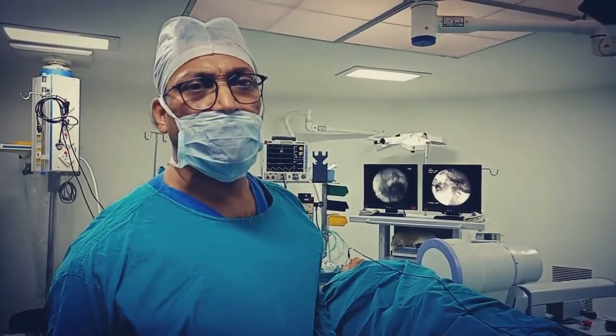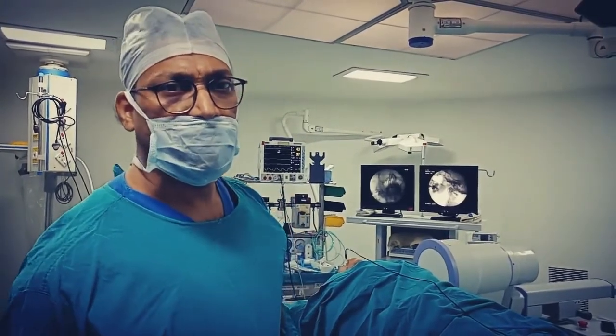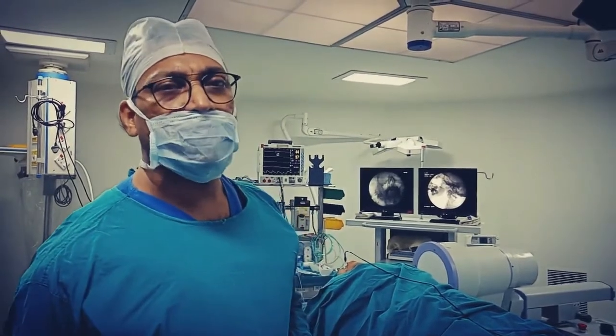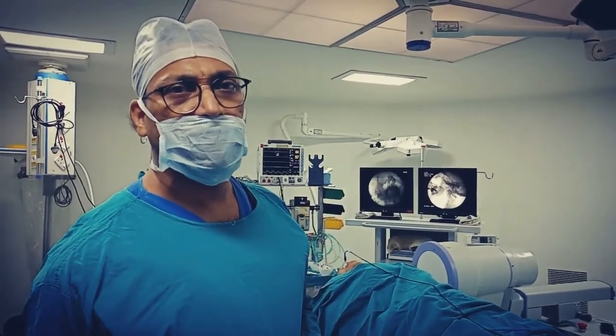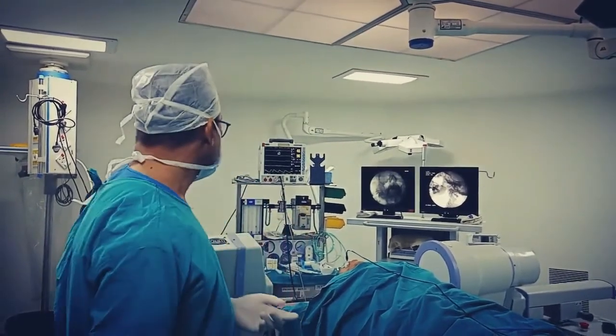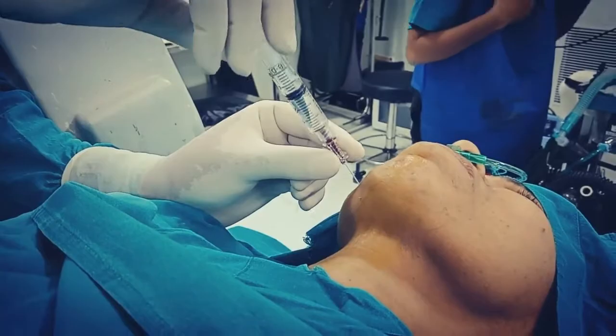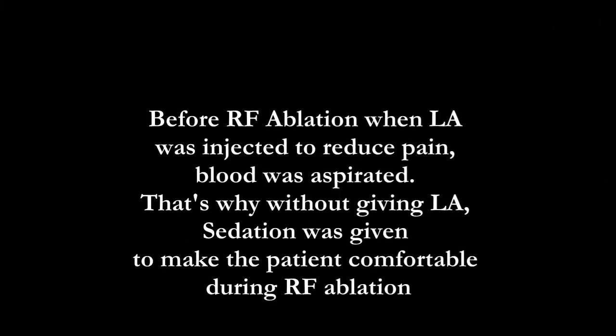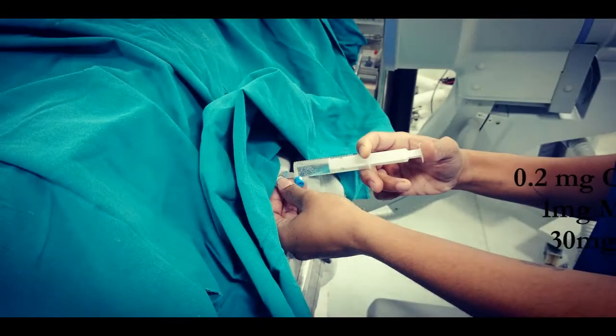I will go for conventional radiofrequency ablation at 75 degrees centigrade for 35 seconds. Usually local anesthesia is given before RF, but here blood was aspirated, so we have to give a little sedation so the patient can tolerate the heat of the RF.